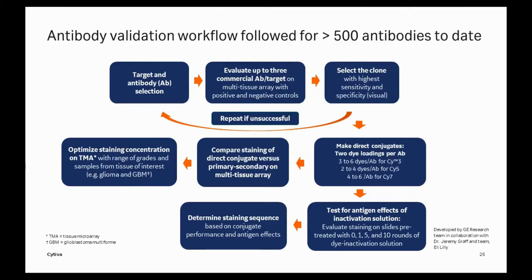We really, as I said, focused on antibody validation workflow, and this is where I want to emphasize for just a moment that we worked out this very rigorous workflow, which we still use today. At the time when we started to work with Eli Lilly, Dr. Jeremy Graff, who we worked with at the time, was extremely helpful and rigorous with us in advising us how best and what they would need from a pharma direct perspective. And this certainly maps to every other collaborator that we worked with since.